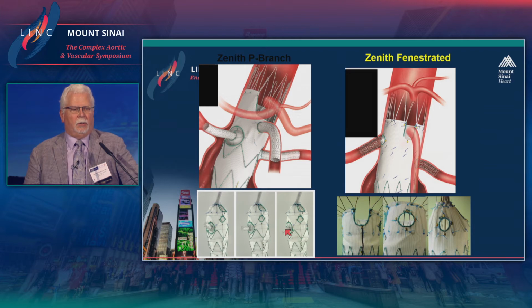So this pivot technology is really what's made the difference of making this a more off-the-shelf technology compared to the fenestrated grafts, where fenestration simply means hole, and you have a graft there, and then the bridging stent is angled relative to this fixed point. Rather than the fenestration, the pivot here will move and give you a better seal zone.